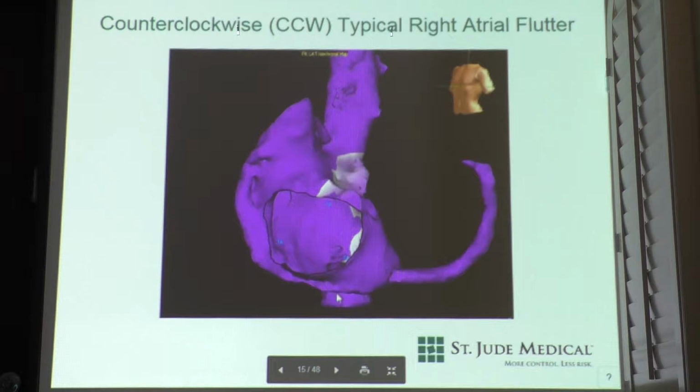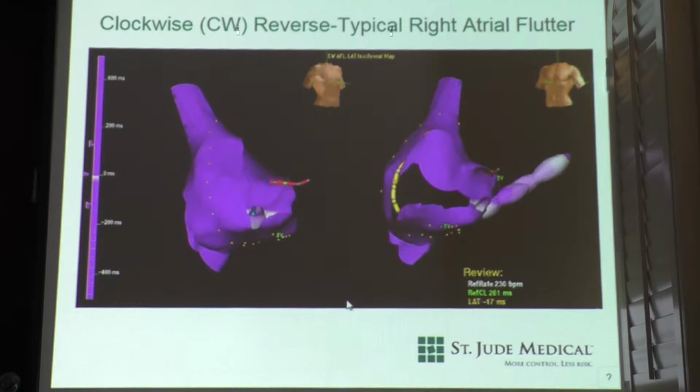But you can see this little bit right here. This is a very easy path to cut. So we did one of these this morning, right? You put an ablation catheter starting here at the valve, and you drag back while it's on, obviously, and you create a scar. So that's kind of the straightforward one.